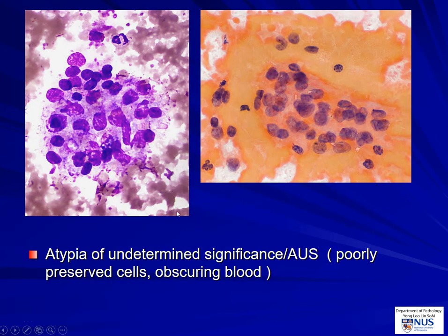Here is another case, which is different because the atypical features lie more in the nuclei. There is a hint that the nuclei are somewhat pale and oval. There may be small nucleoli, but it's difficult to be sure because of the artifactual changes and entrapment in blood clots. This would be an example of the atypical category with nuclear atypia.